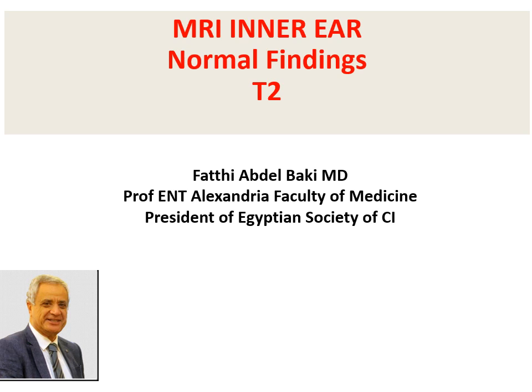Hi, I'm Dr. Fatthi Abdel, Professor of ENT, Alexandria Faculty of Medicine, Egypt, and I'm going to present on MRI of the inner ear for cochlear implant, normal findings. And in this video, I'm going to concentrate on the T2 sequence.